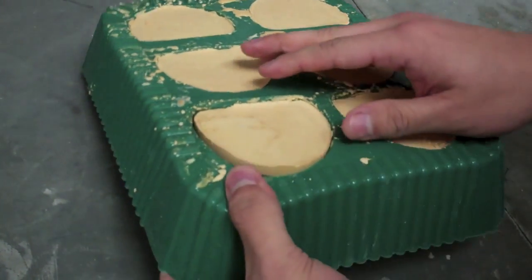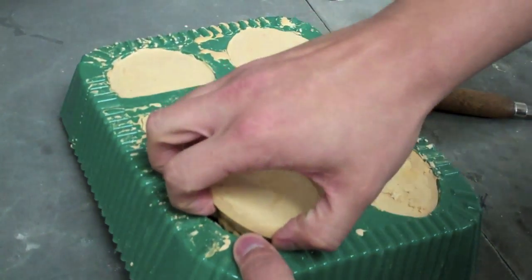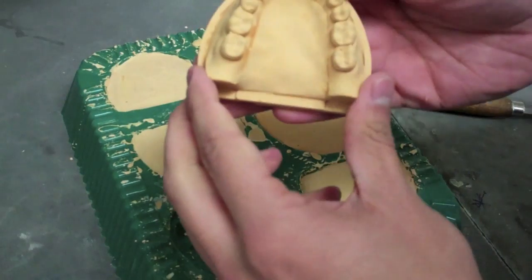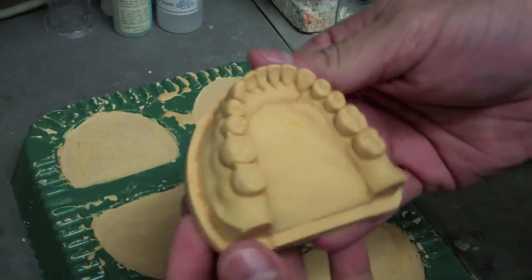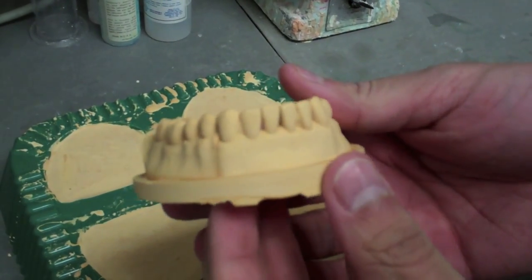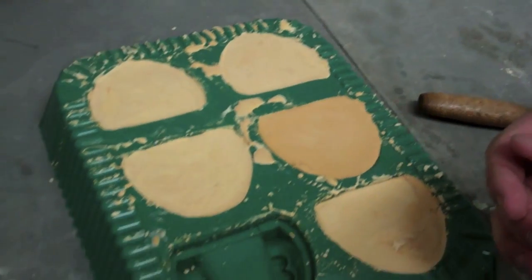Once all six models are set, you may then begin to wedge out the models from the mold. Do this gently with a side-by-side motion to ensure none of the teeth break. Remember to check the models for any discrepancies. If any occlusal surfaces contain bubbles or voids, the models may have to be re-poured.